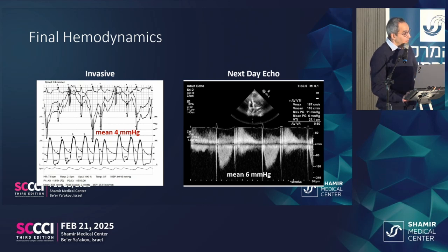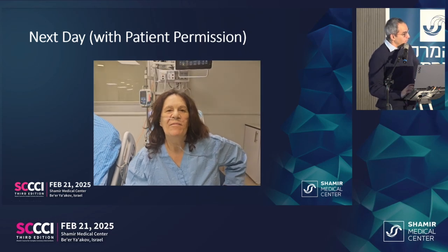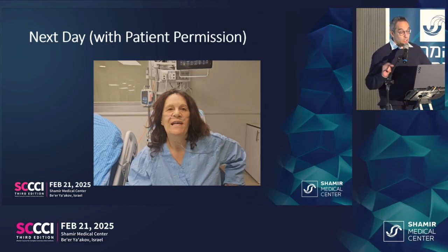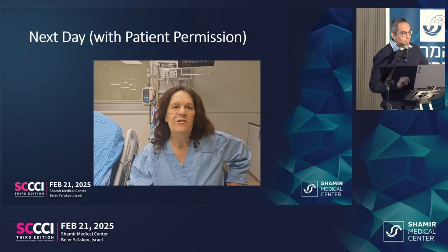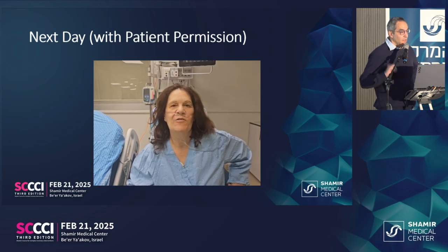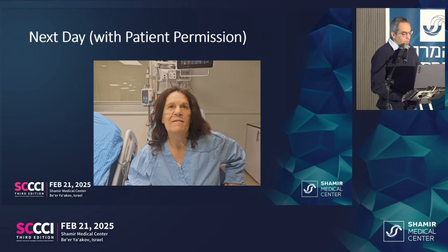And with permission of the patient, here is the patient. Let's see if it works. The video is not working, but this is the patient the next morning. She was not intubated. We didn't have to intubate her. We did CPR, snared with a Terumo wire, and proceeded with the case.